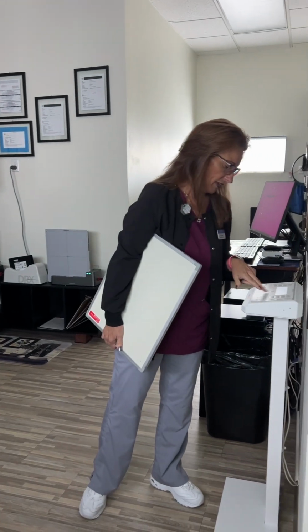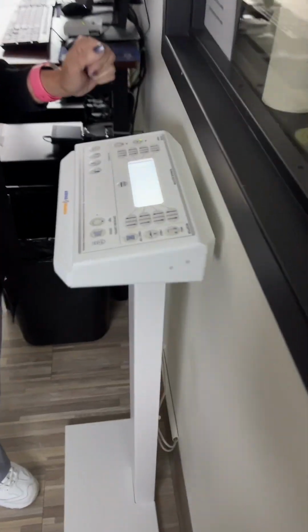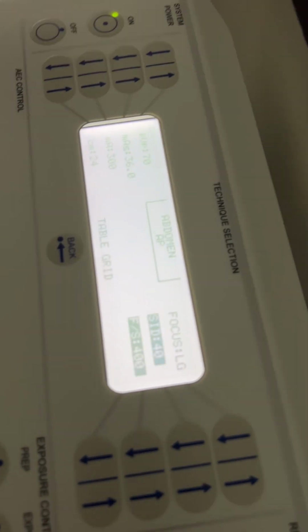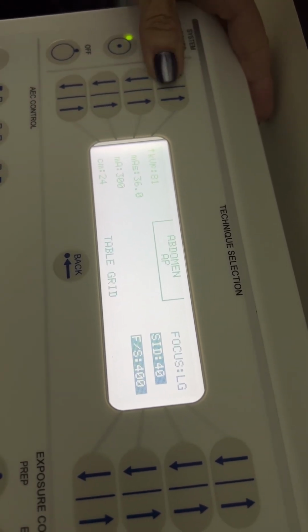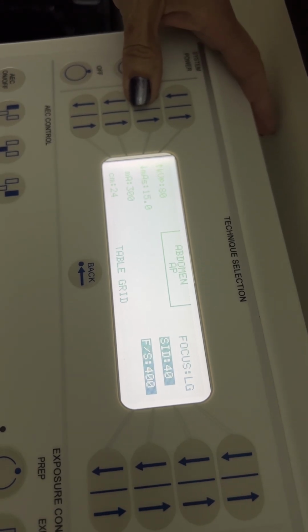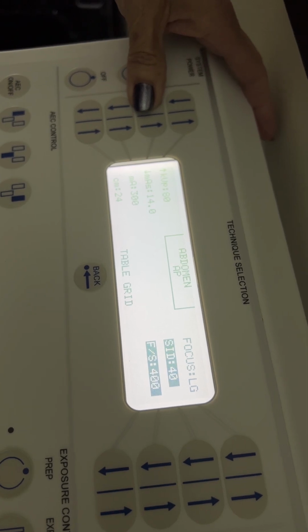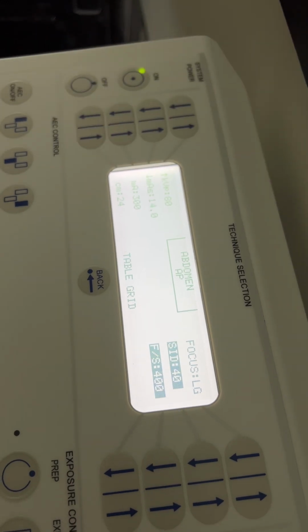So before I grab him, I'm gonna set the control panel. And on here, we are gonna pick abdomen and then AP. And then we're gonna set this. Now, a sthenic patient would be 80 at 10 mAs. On Andrew, probably do 80 at 14, and we're on table grid at a 40-inch SID.